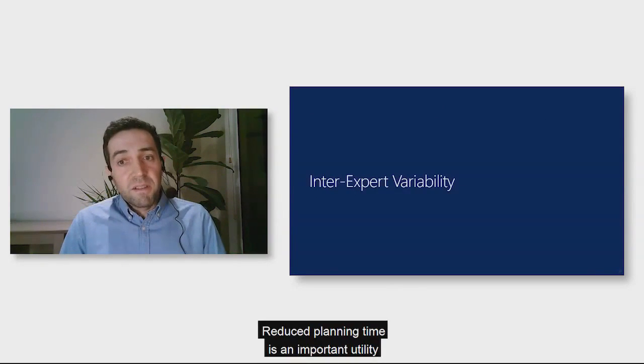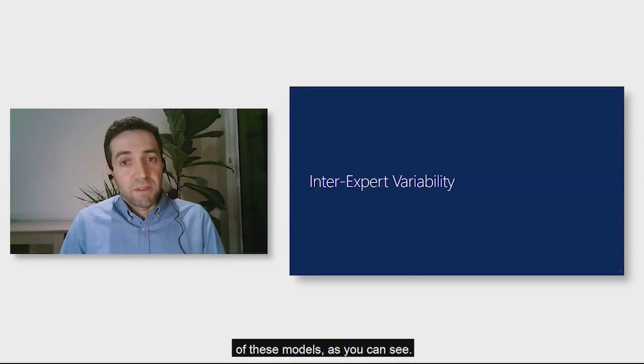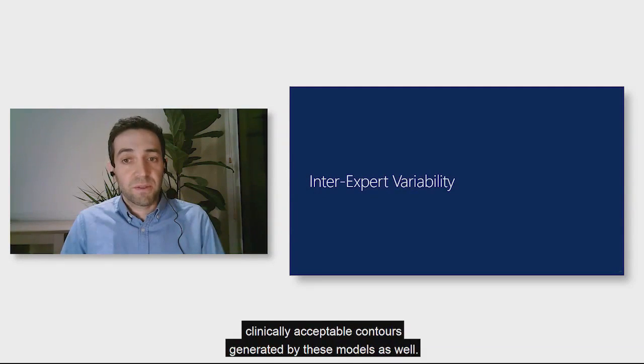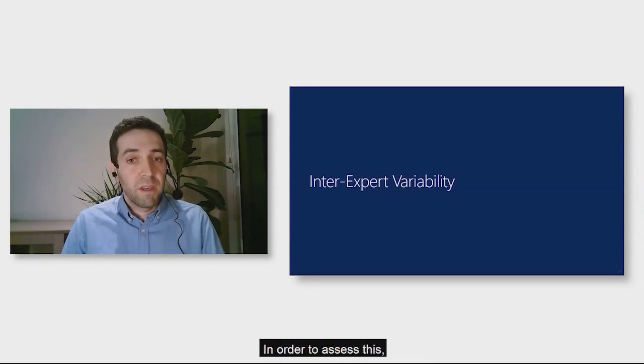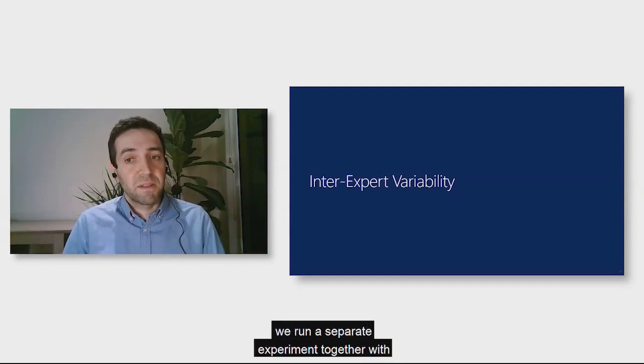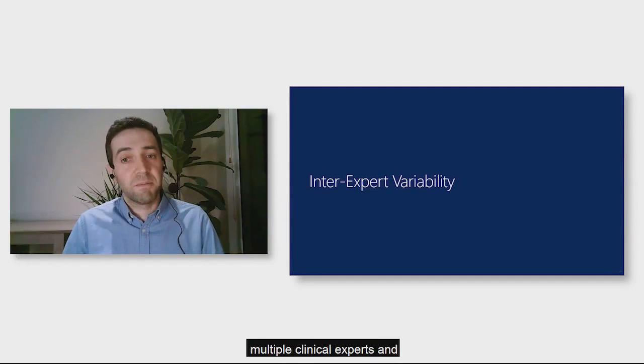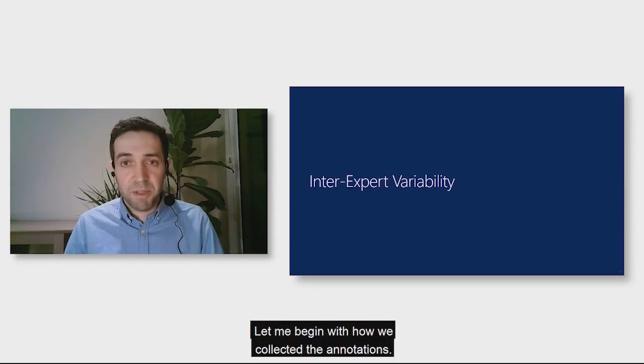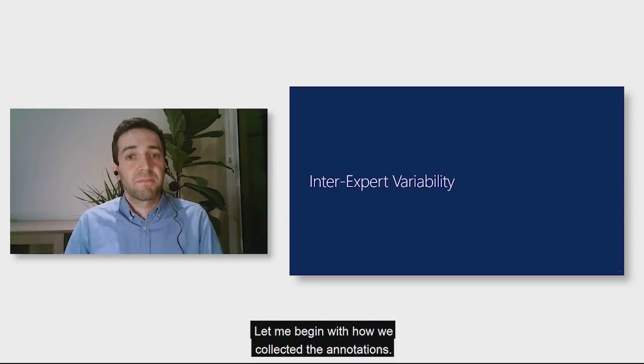Reduced planning time is an important utility of these models, as you can see. However, this should be complemented by clinically acceptable contours generated by these models as well. And in order to assess this, we ran a separate experiment together with multiple clinical experts and measured the inter-expert variability in this contouring task on a subset of images. So let me begin with how we collected the annotations.